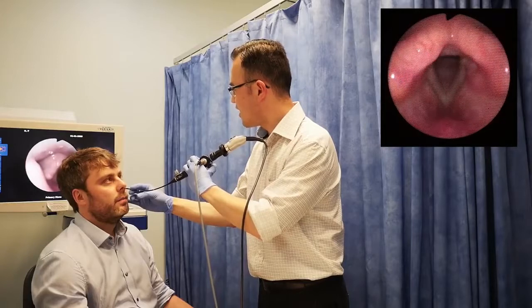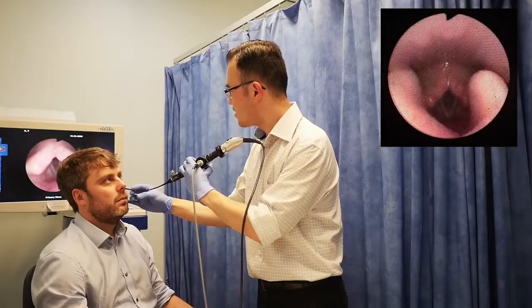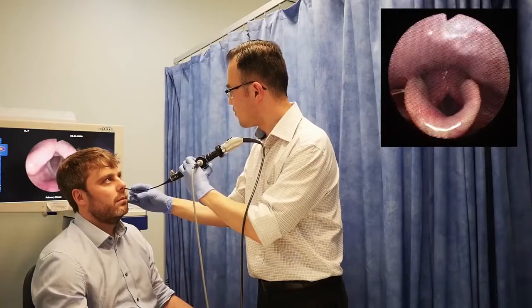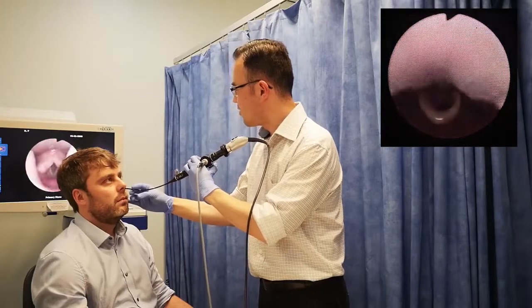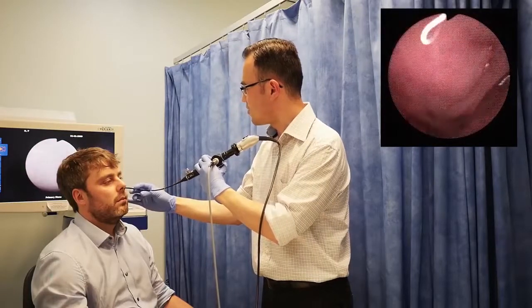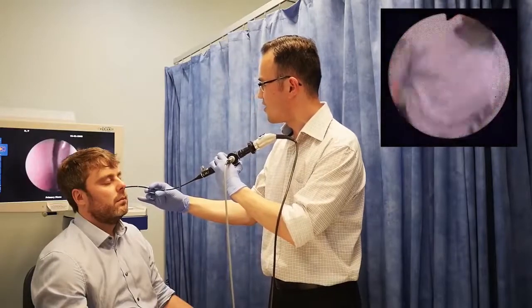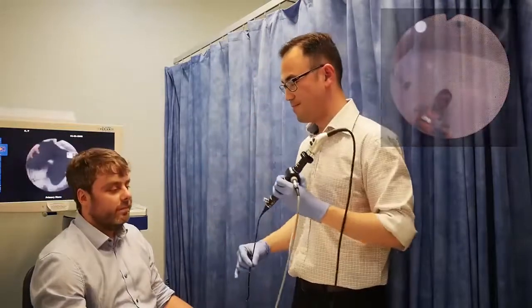Good. And if possible, if you sprayed it up very nicely, you can also sometimes just pass the scope past the level of the vocal cords. Okay? Right. And as I come out, I'm just going to straighten the scope as we come out of the nose very gently. Well done.